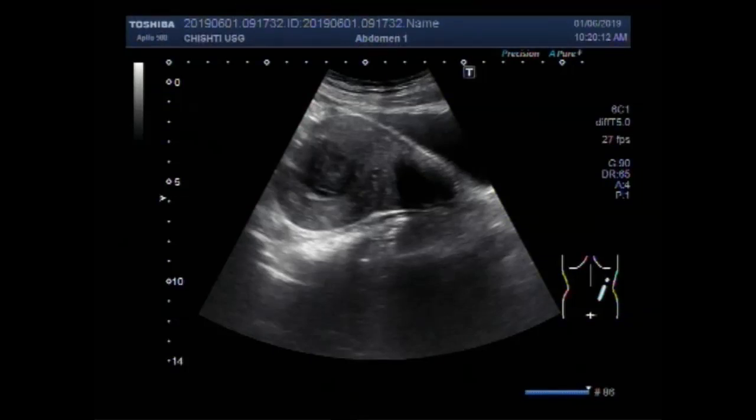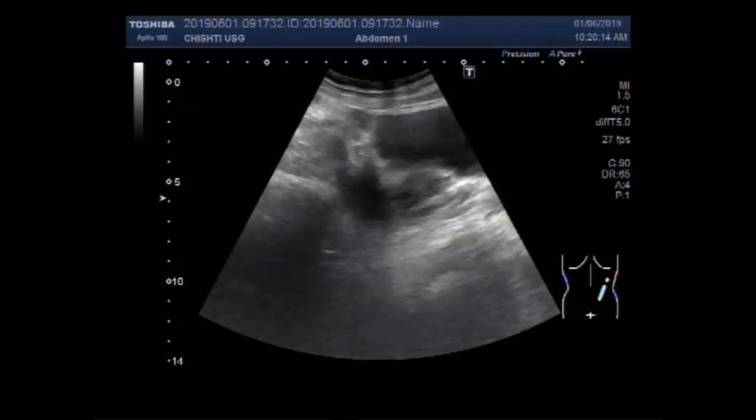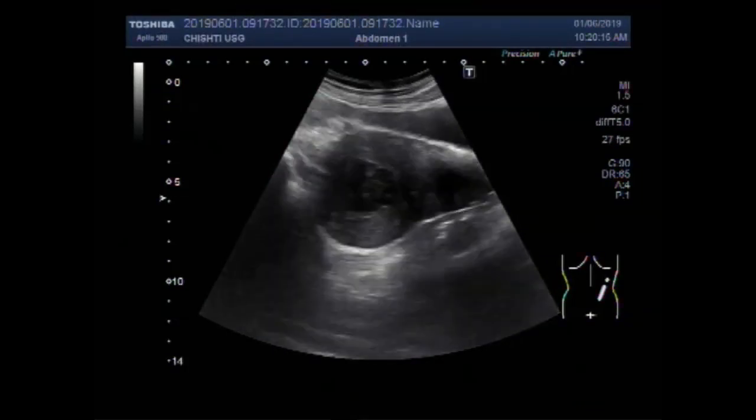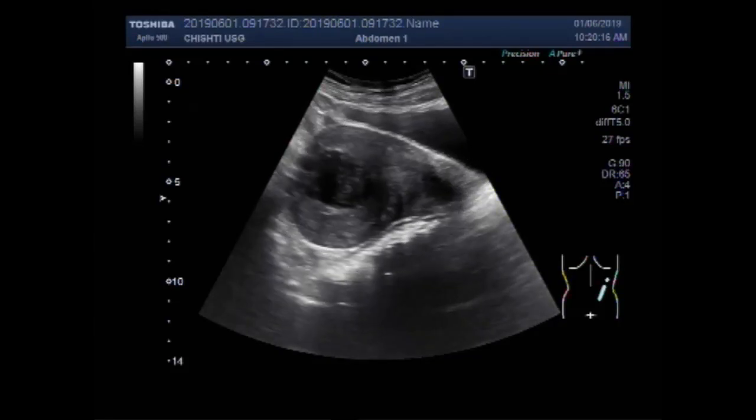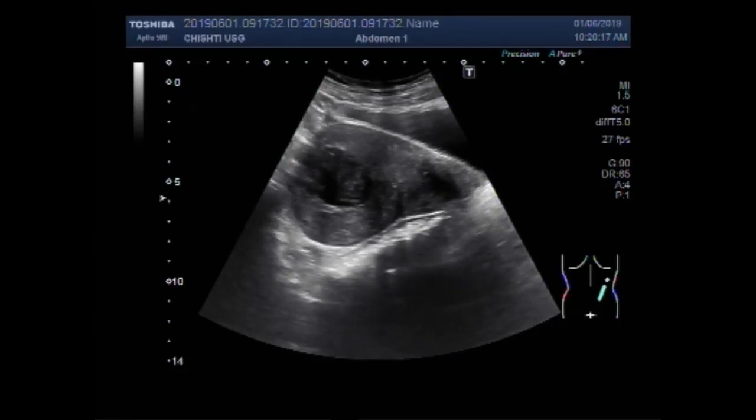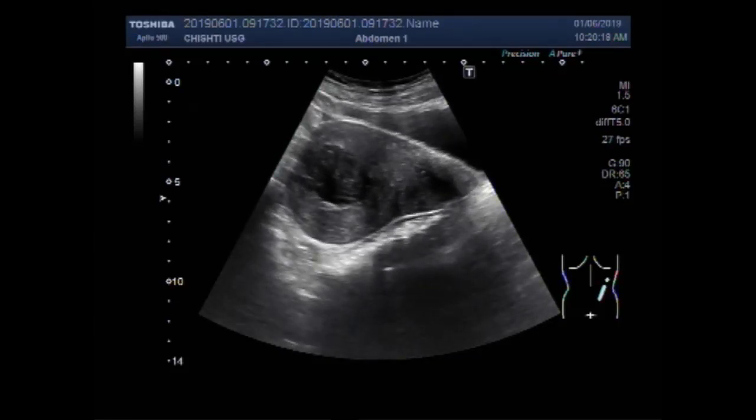Dear viewers, I hope you are all fine. This ultrasound video shows a large uterine mass.